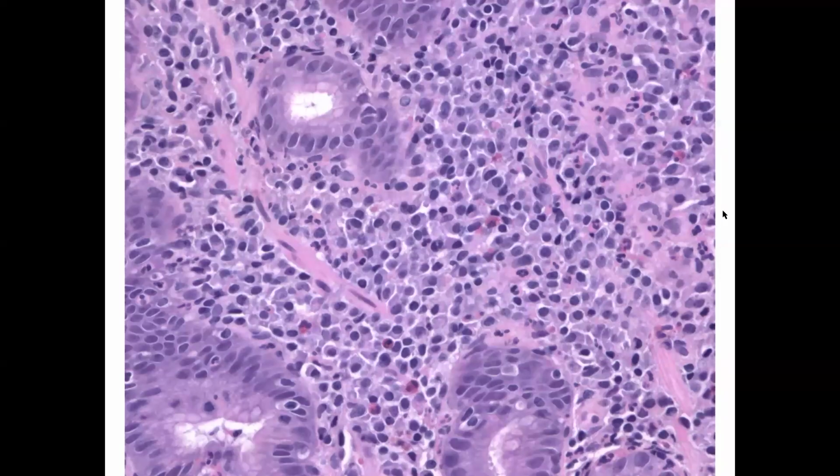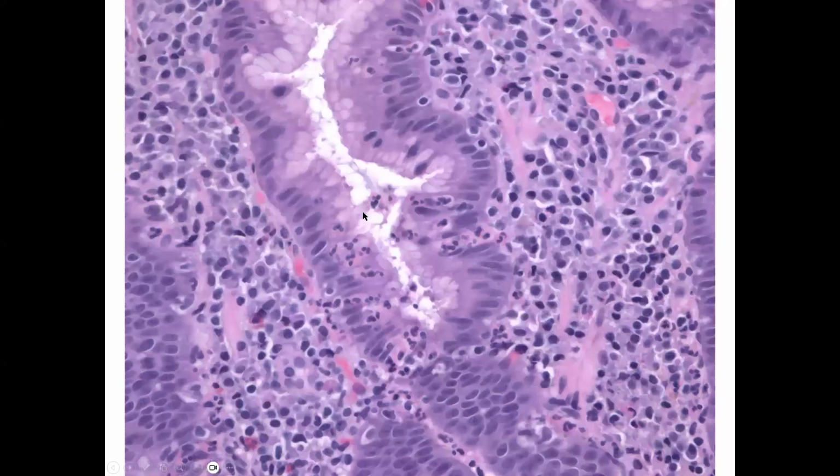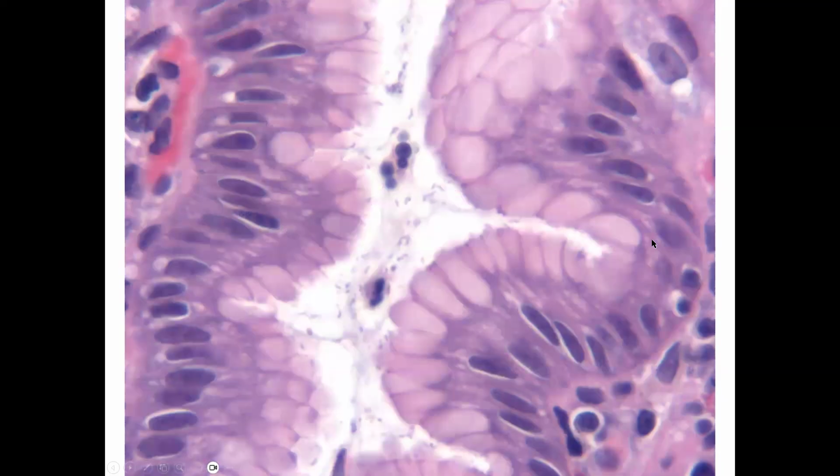When we look at that, we can recognize that there are many, many plasma cells in here. There's also some lymphocytes, and scattered around, we see some neutrophils. And here's an example with a lot more neutrophils. So there's really a lot of inflammatory cells, specifically neutrophils, within the epithelium here. And so this is what we call activity. And so there's some chronicity with the chronic inflammatory cells, the plasma cells, and to a lesser extent lymphocytes. And then there's some activity here. So this would be chronic and active gastritis.